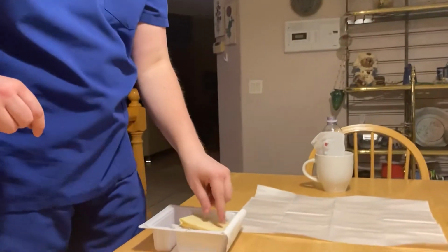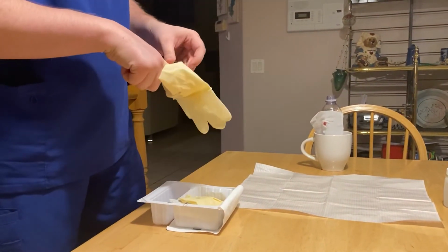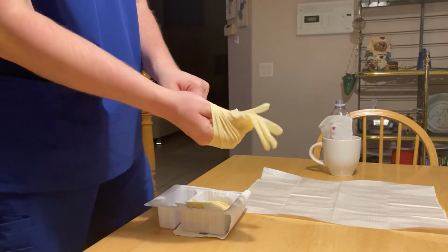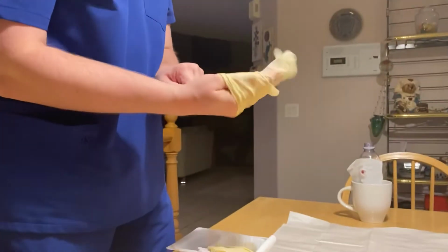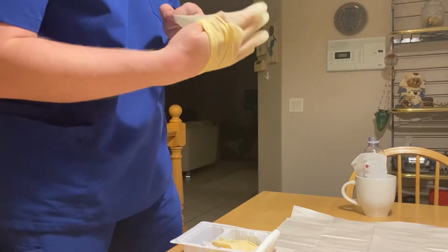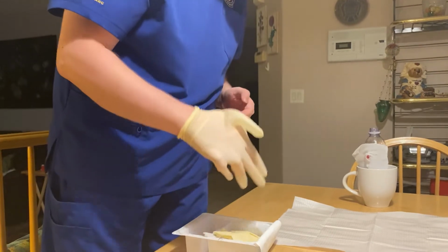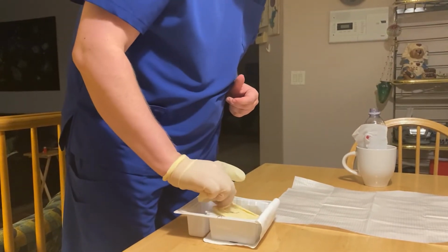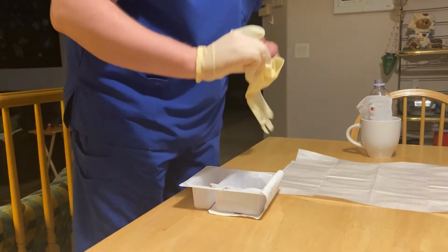So then I would grab my gloves and start to put them on. Oh, I think this is the wrong hand. No, I just missed the thumb. Fix it in a minute. So I would grab the next one. It's a bit big, so I have to unfold it. There we go.